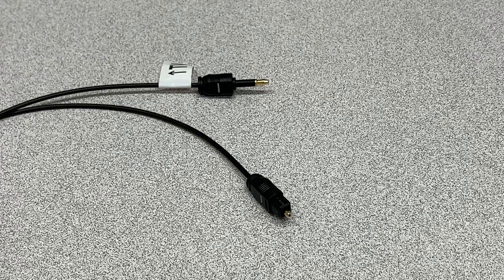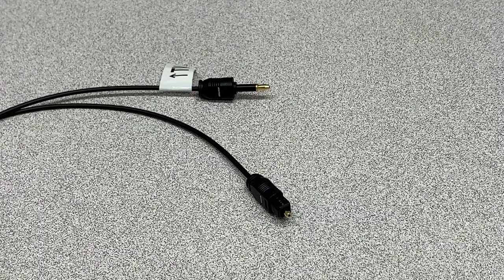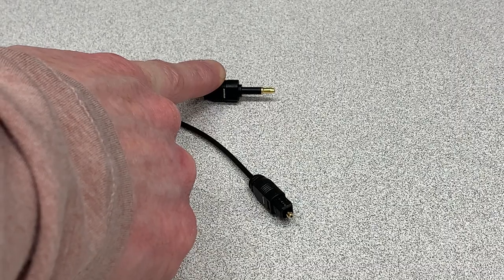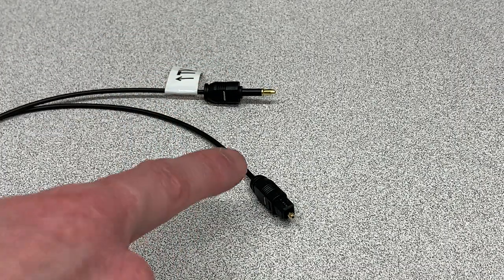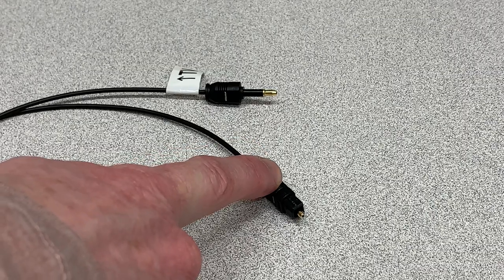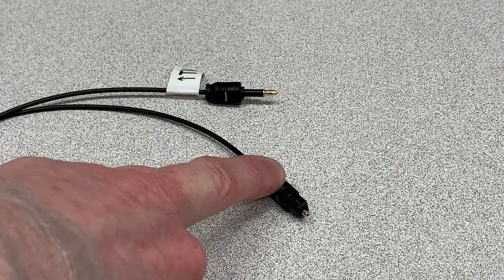Next you have the optical audio cable. You'll notice that one end has a long male adaptive plug-in — that's the one that goes into the back of the TV connector. The other end is the actual connection that goes into the back of the media source, the TV, or a compatible monitor.